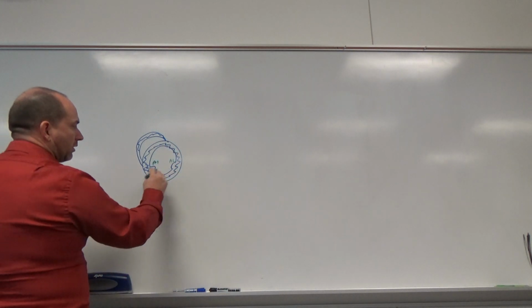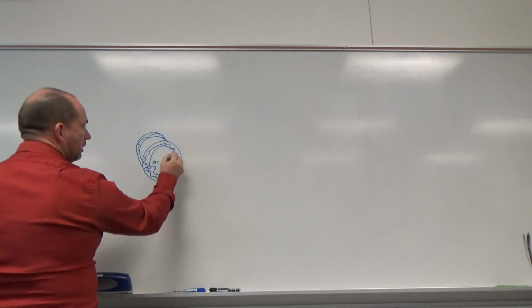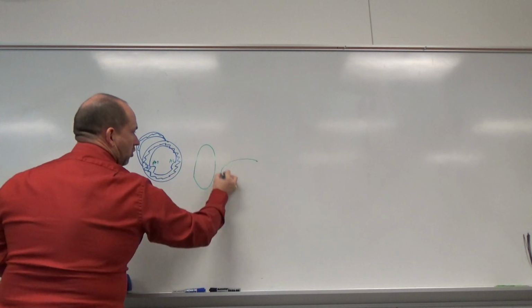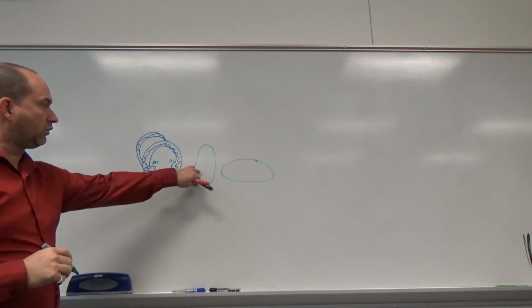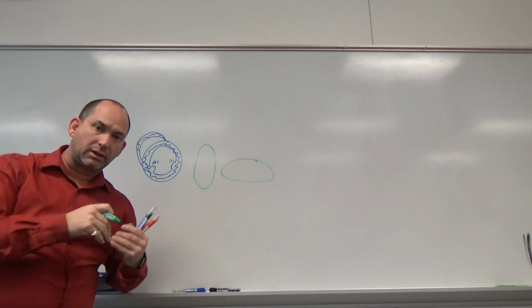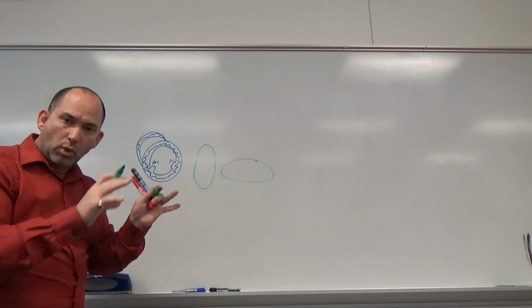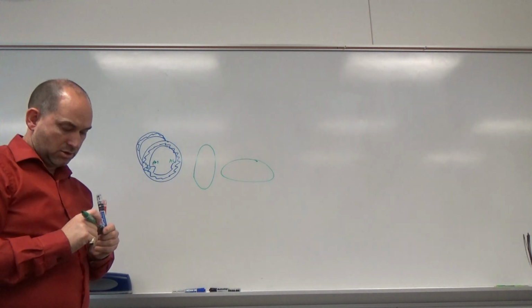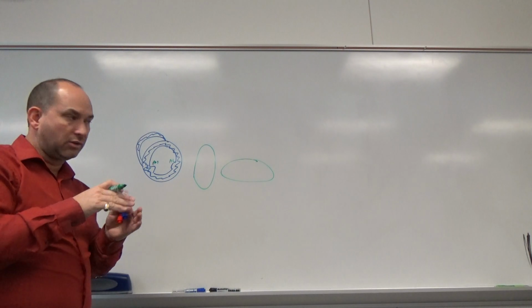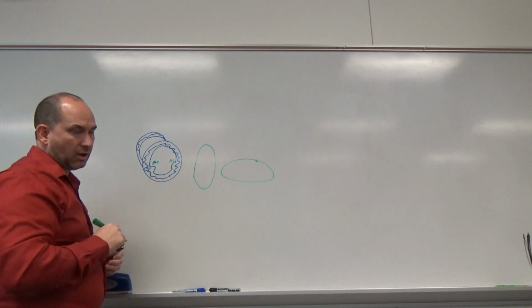No valves in this level. The papillary muscles should not be free-floating. They should be attached to the wall. This should be round. It should not be oval this way. It should not be oval this way. If we're oval this way, that means we're too high up or too low, and when we're angling in it, we're getting it obliquely. If it's oval in a wide shape, then it means that we're rotated incorrectly. We need to rotate it so that it's round, unless the heart truly is abnormal.